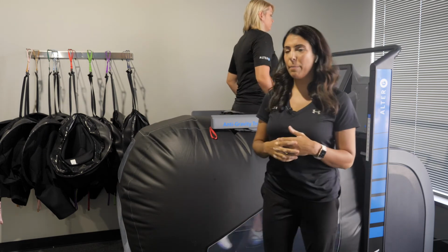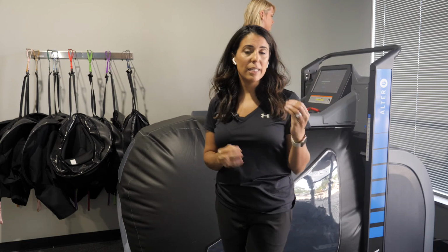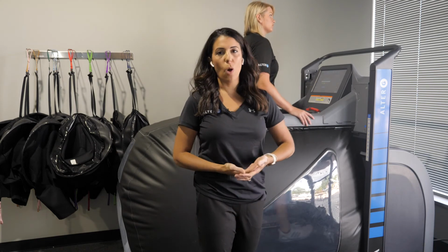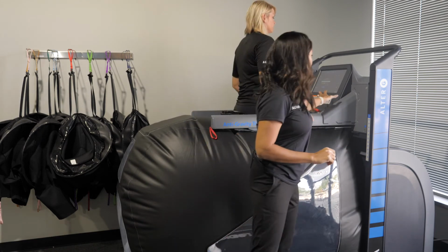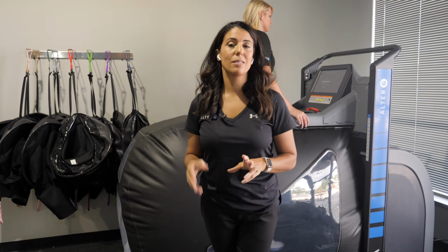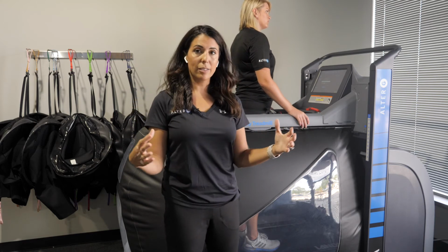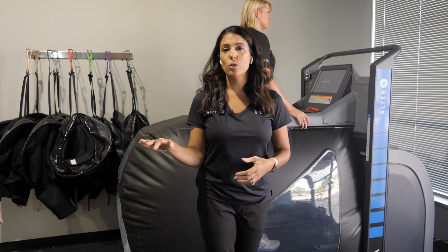So before I stop Katie from using the machine, I'm going to show you some exercises that can be done and how to perform exercises without the treadmill belt going. So right now we have the treadmill running, she's walking, she's working on her walking. At any point I can press the pause button. A key thing is to press pause and not stop. When I press the pause button, the treadmill belt has stopped, but the body weight support remains intact. So I can still, at this point, adjust the body weight percentage without having the treadmill belt running.